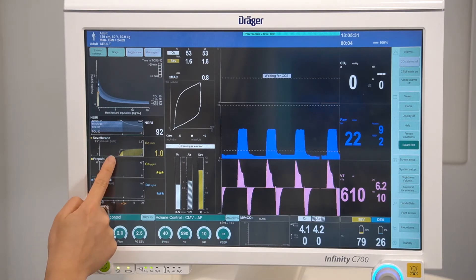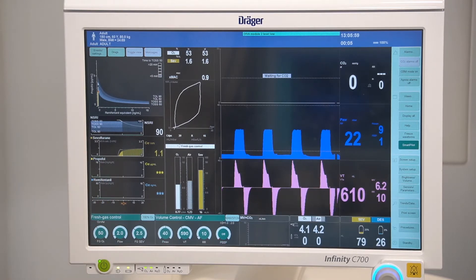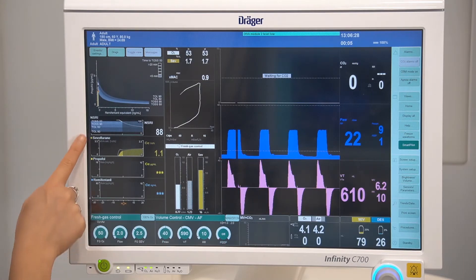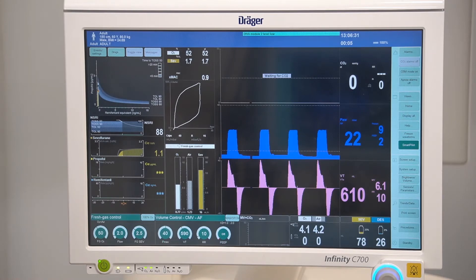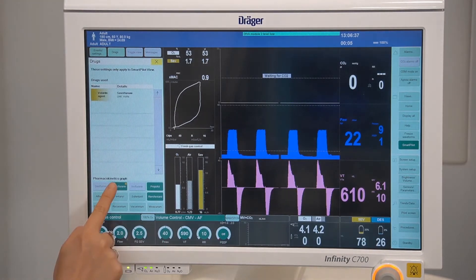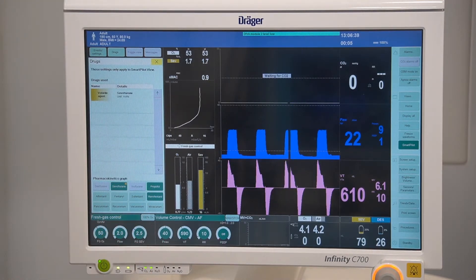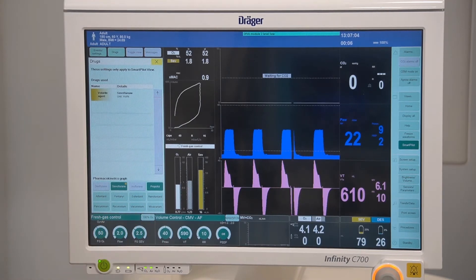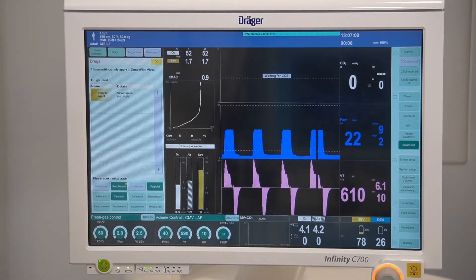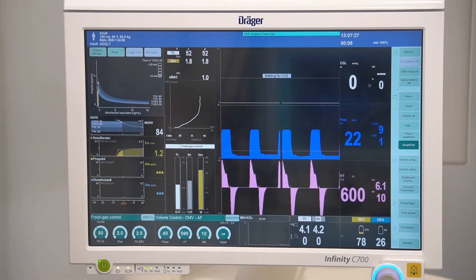Up to three drugs can be displayed with the time scale located on the bottom. You can see that the anesthetic agent has already populated onto the screen from the time that delivery was commenced. For users with syringe drivers connected to their Zeus IE, this information will also automatically be displayed. To change the drugs displayed, select drugs from the top menu. Your active drug selection is displayed in dark green, with your available options in light green.